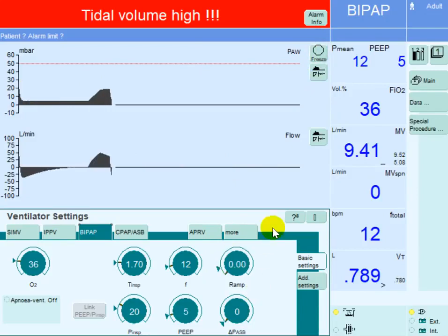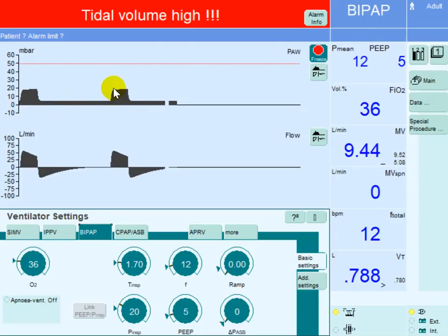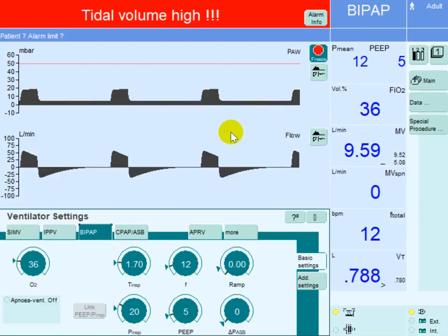You can also set the rise time to 0, so the pressure will go up from the PEEP level all the way to the peak inspiratory pressure in no time. This way you can gain more of the area under the curve, which helps with improving oxygenation — we will be talking about this in a different video.